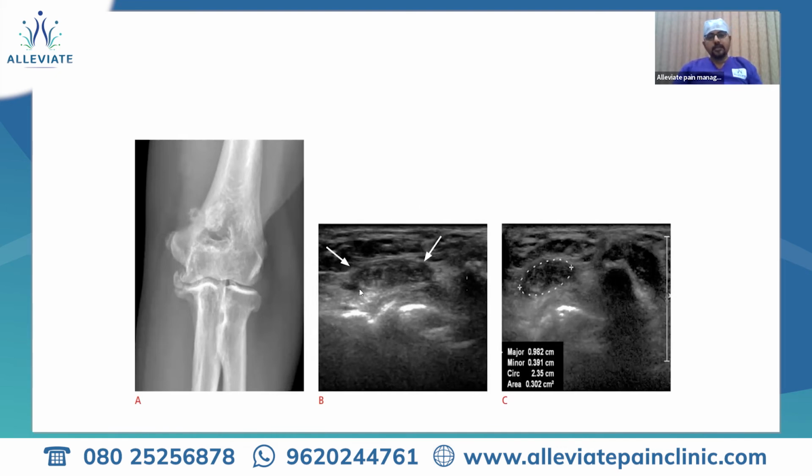This can be involved in post-surgical scars also, because we had a case wherein they had done a surgery for nerve entrapment and nerve release, but unfortunately the nerve got entrapped in the scar of that particular surgery. So the patient was having persistent pain and wasn't even able to wear her bangles. She had that much hyperesthesia and allodynia in the volar and volar medial aspect, and with multiple perineural prolotherapy sessions, she has been doing quite well now.